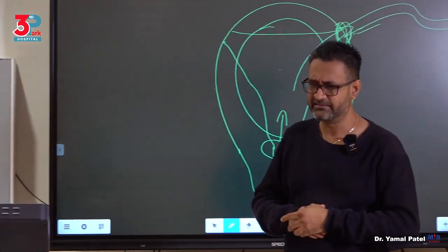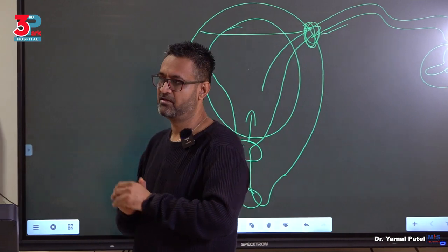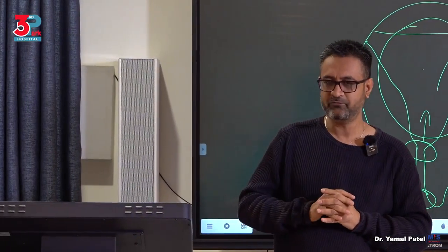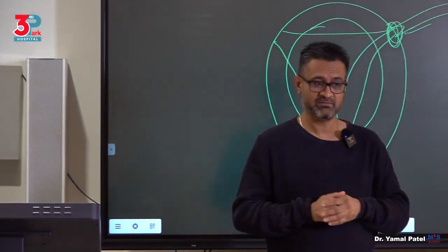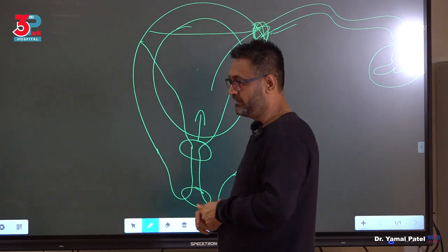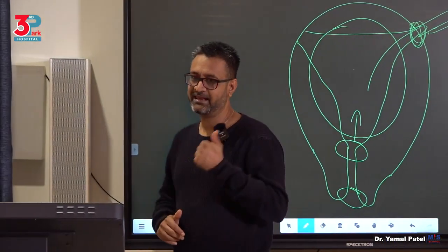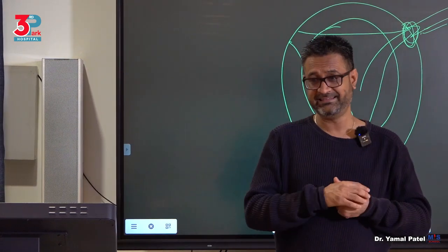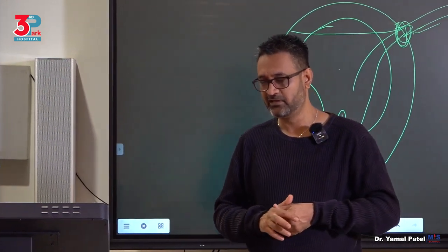So it's a very dangerous scenario to have an overload of a hypotonic solution. Same with hypertonic, again, there is a problem. You will get dehydration, okay? Whereas if you take isotonic, the electrolyte imbalance issue will not be there. But what can still remain is fluid overload.